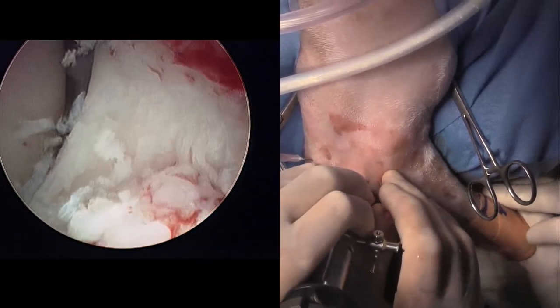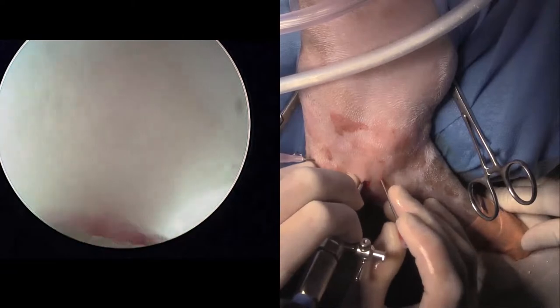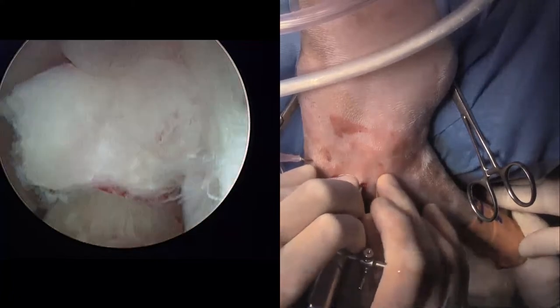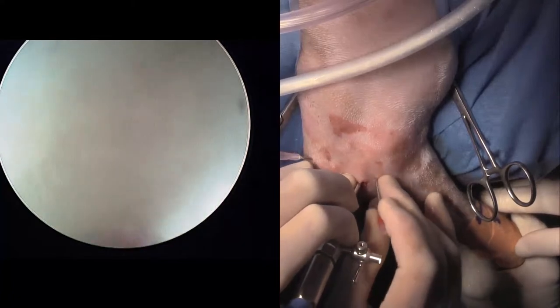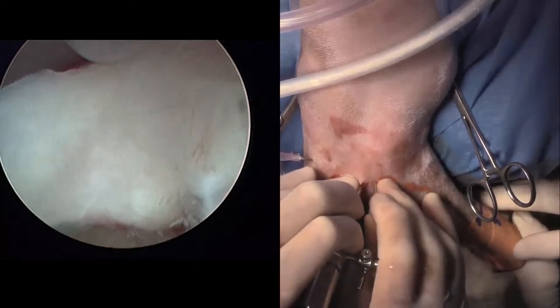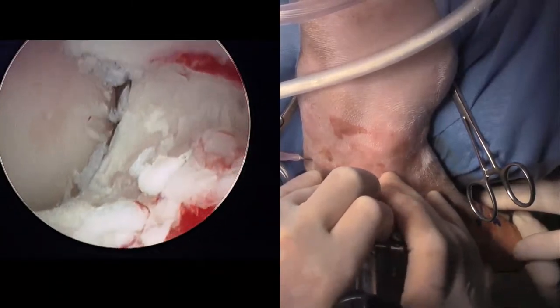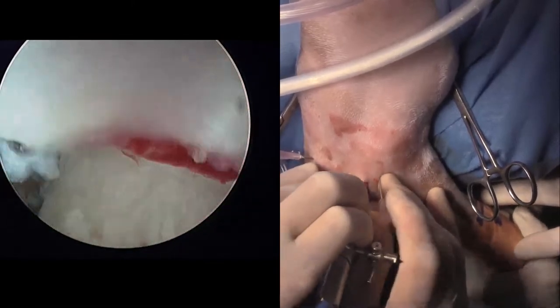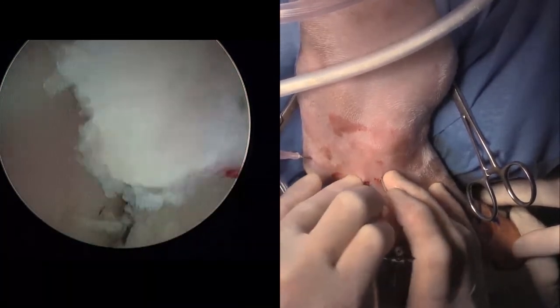Internally rotate, externally rotate a little bit. Yeah, so that's radius there, and that's my fragment out there. So I just need to identify my needle within the joint. Elbow dysplasia, I would imagine. Okay, so I can feel my needle within the joint. I just can't find the tip of the needle.